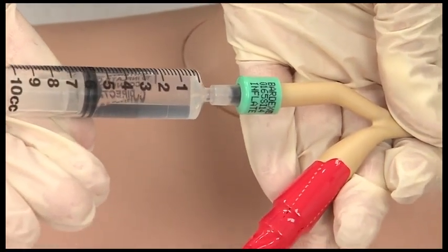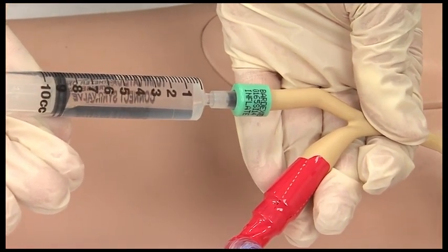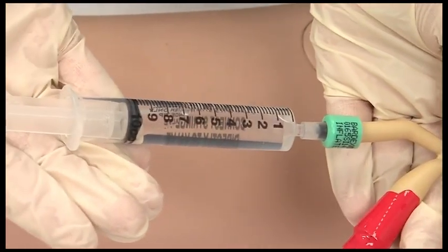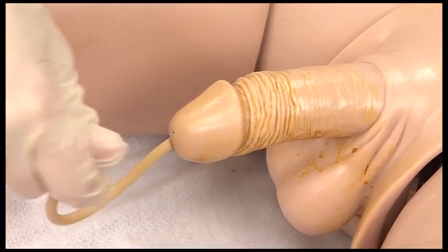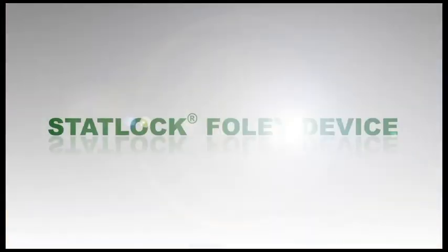All of the water should be removed from the catheter balloon. If the balloon will not deflate, and if permitted by hospital policy, the valve arm may be severed. If this fails, contact adequately trained personnel for assistance, as directed by hospital policy. Should balloon rupture occur, care should be taken to assure that all balloon fragments have been removed from the patient. After the balloon is deflated, remove the catheter and discard it according to hospital policy.